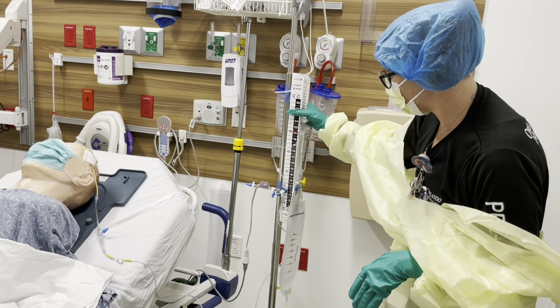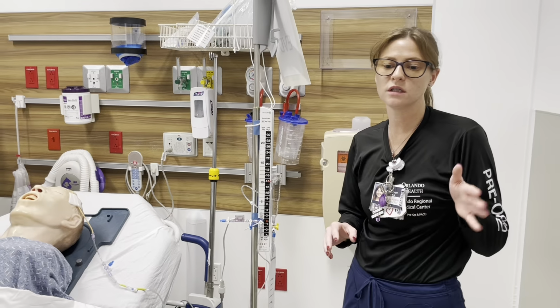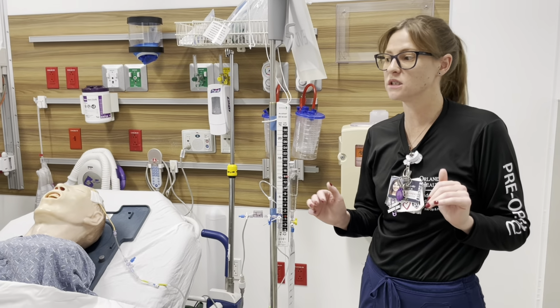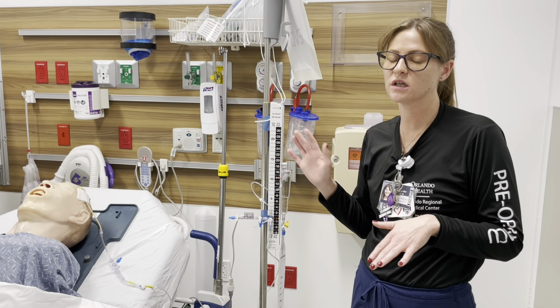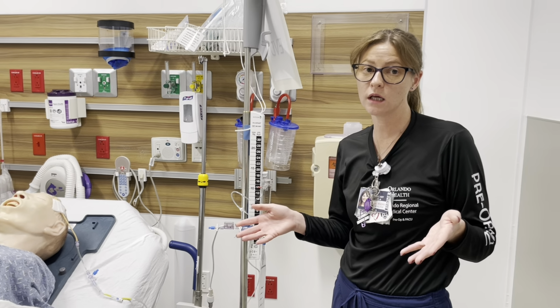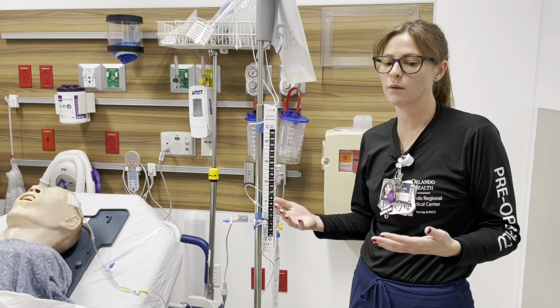So at this point, our patient is still clamped because we just set this up. ICP is going to be between 0 and 15. Everybody's going to be a little bit different. When they first come out of the OR, it may not pick up a great ICP because maybe they've drained a lot of fluid in the OR. Typically, if it was put in at the emergency department bedside, you're going to get some type of ICP.